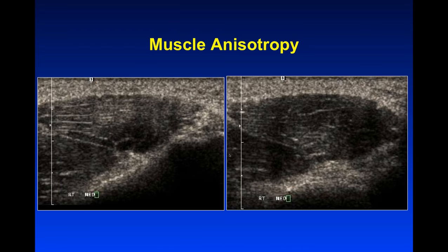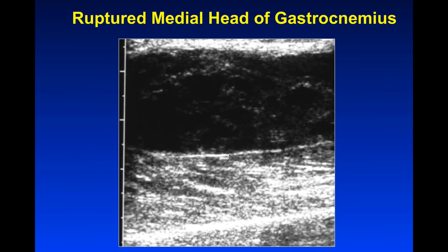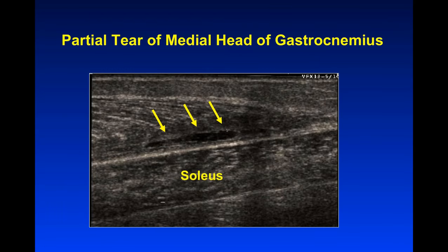A normal muscle has a pennate pattern, and when it's abnormal we lose that pattern. This is somebody who was playing tennis, felt a pop in the calf — the pennate architecture is gone and replaced by an amorphous hematoma. The whole medial head of the gastrocnemius ruptured, with the intact soleus muscle deep to it for comparison. This is a partial tear of somebody who was dancing at a party, felt a pop, some swelling and bruising — the gastroc muscle pulled away from the fascial attachment: a partial tear of the medial head.